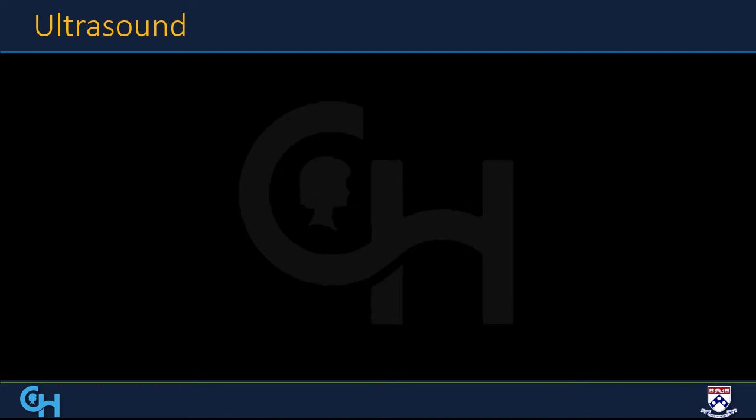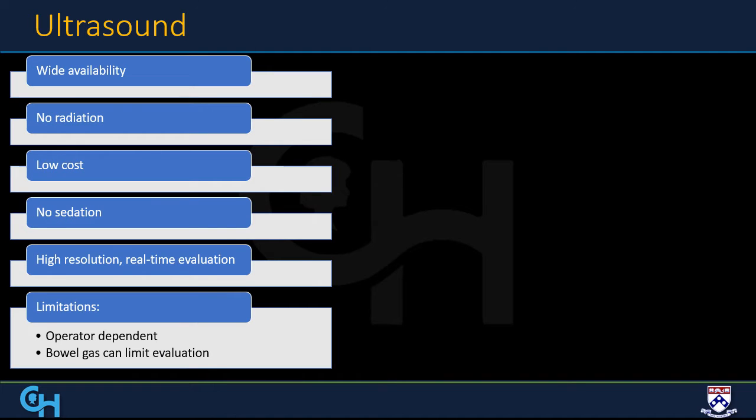The first modality that we're going to talk about is ultrasound. Ultrasound is a great evaluation for the bowel. It involves no radiation, it's low cost, there's wide availability. Typically, patients don't require sedation. It's high resolution and real-time evaluation. Limitations, of course, are operator dependence, and bowel gas can limit the evaluation.